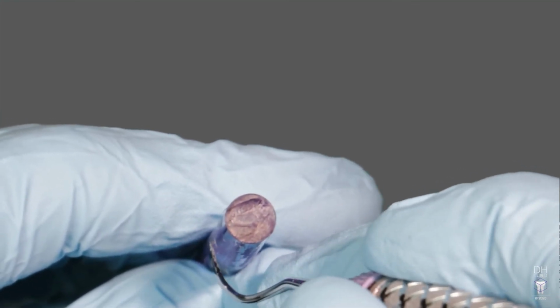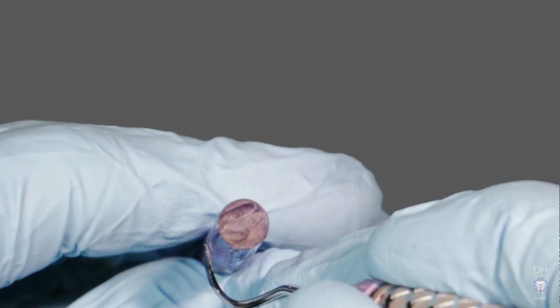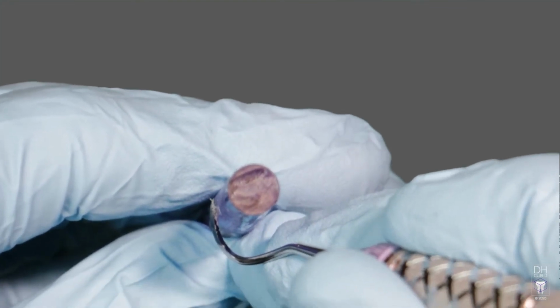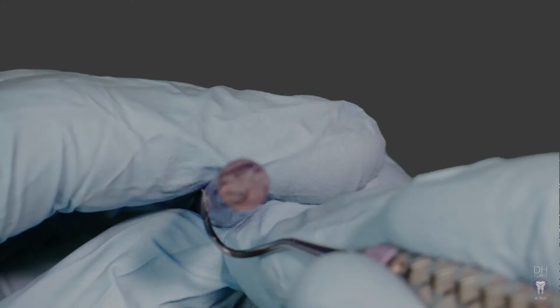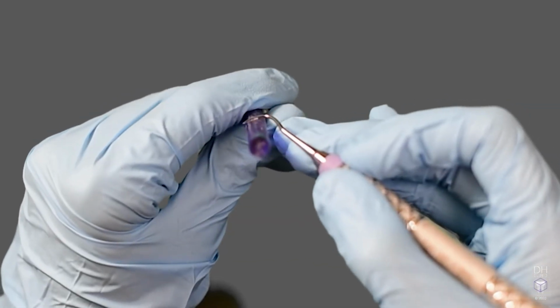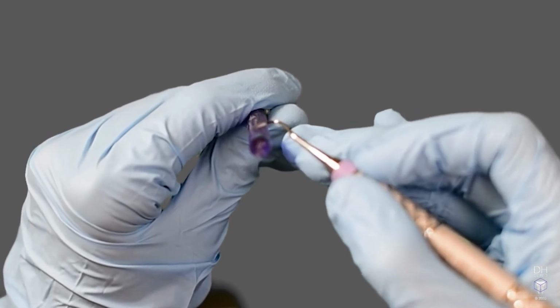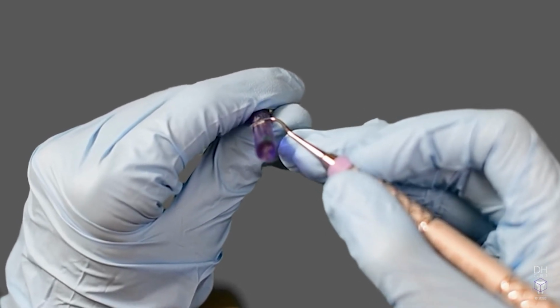In this video, the hygienist is applying a fair amount of pressure to get the instrument to bite the stick. This is an indication that the instrument is still fairly dull. Therefore, we recommend you lightly place the instrument against the test stick at the working stroke angle to gently shave the stick with the sharpened cutting edge.